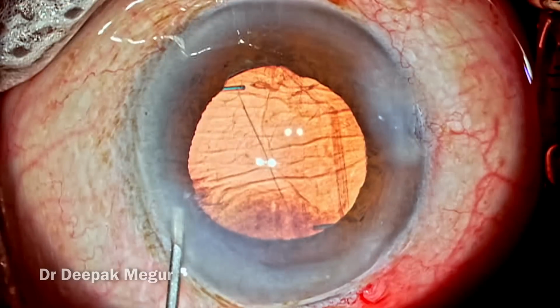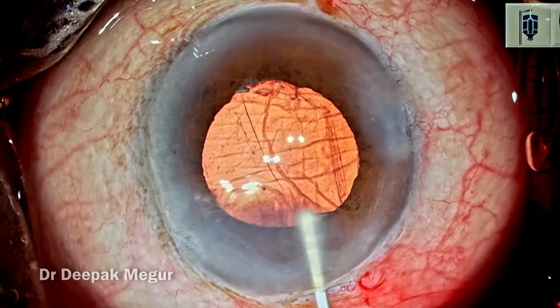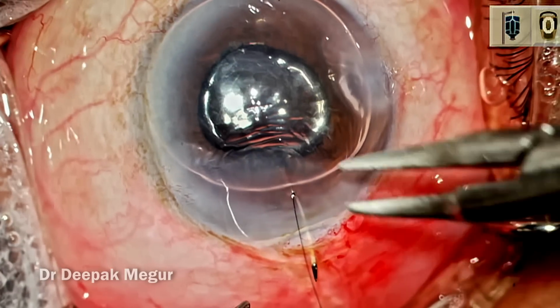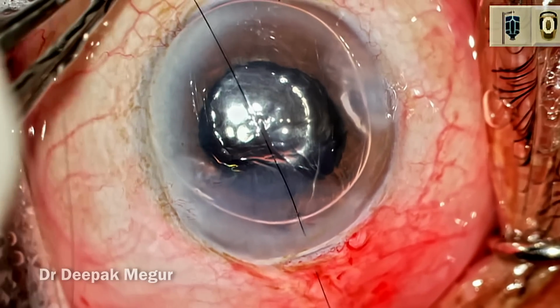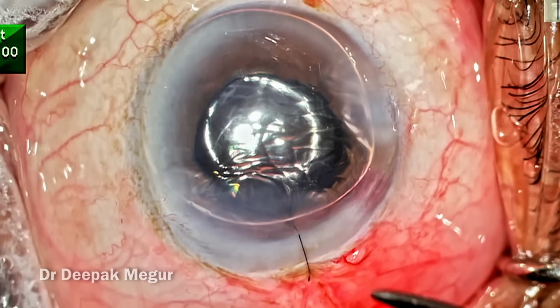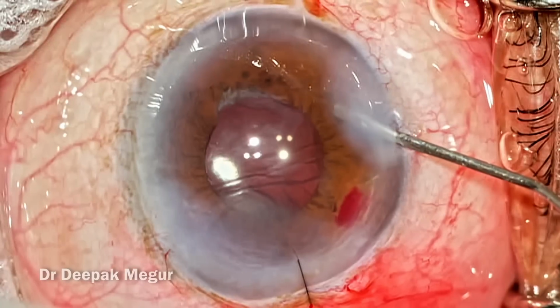The side ports are hydrated and I want to suture the main incision. Before that, I'd like to put some air bubble in the eye and then suture with a 10-0 nylon. So without holding the sclera, we can pass the needle through both the corneal and the scleral end and pull it out. Tie the knot. Knots are buried into the sclera. The air bubble is removed, intracameral antibiotics are placed. That's it, the case is done.